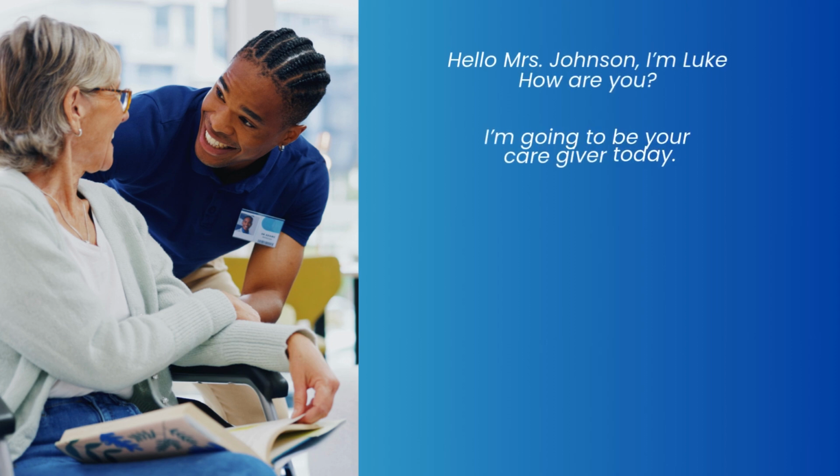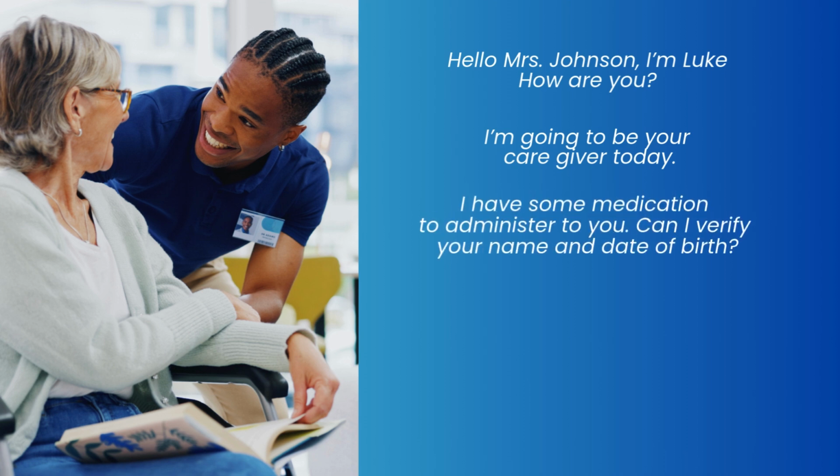Say hello and introduce yourself. Hello, Mrs. Johnson. I'm Luke. How are you? I'm going to be your caregiver today. I have some medication to administer to you. Can I verify your name and date of birth?